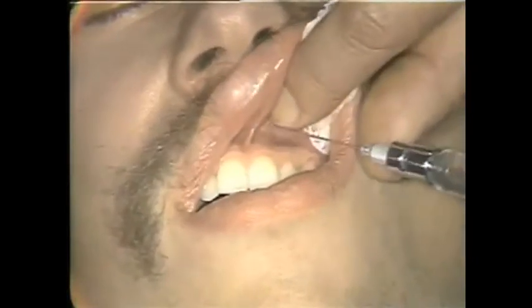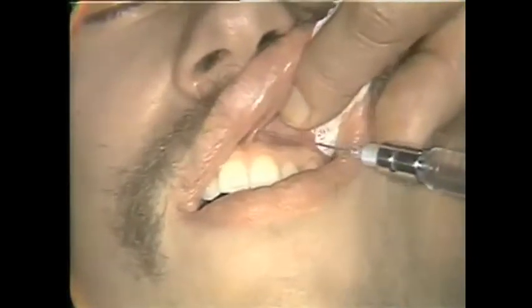Same technique, tissues dry, tincture of betadine, through the vestibular tissues, against bone, and aspiration, and again, injection of 1.5 cc of solution will very adequately anesthetize either the lateral or the central incisor tooth.